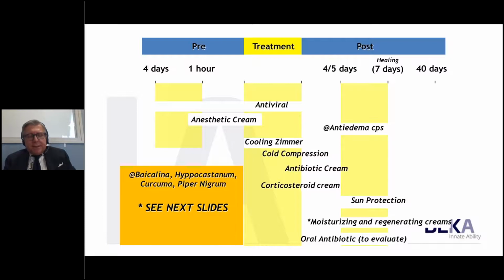In the case of acne scars, you have to stop any kind of isotretinoin treatment 1 month before the treatment. We must be very careful in the treatment, and the skin must present no inflammation when we treat with the fractional CO2 and with the freehand.